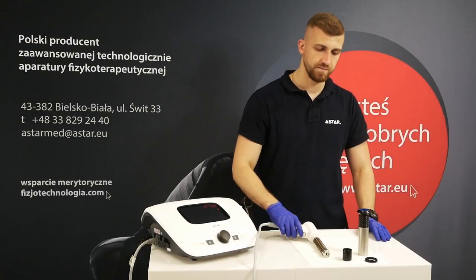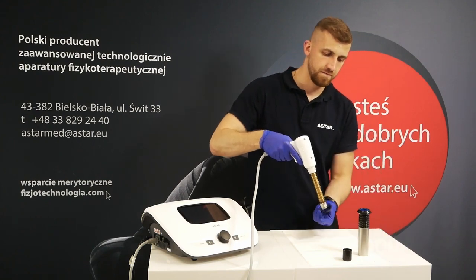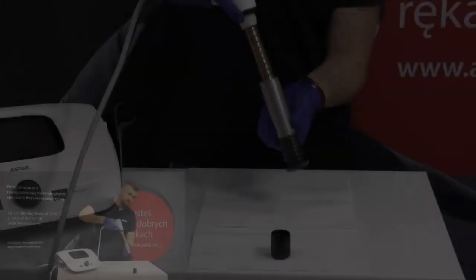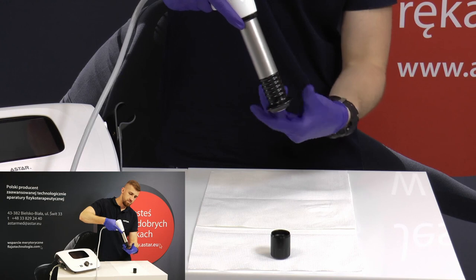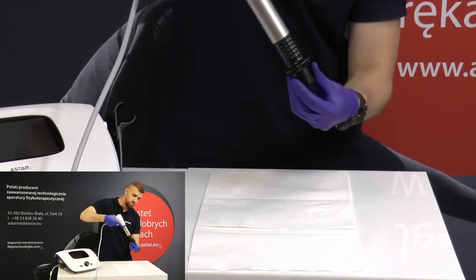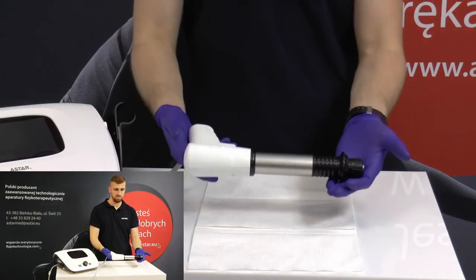Wipe the tube and the applicator dry with a cloth or leave them to dry. When dry, put the clamping ring on and screw the tube back on. Mount the transmitter and tighten until it stops. The applicator is ready for another day of hard work.